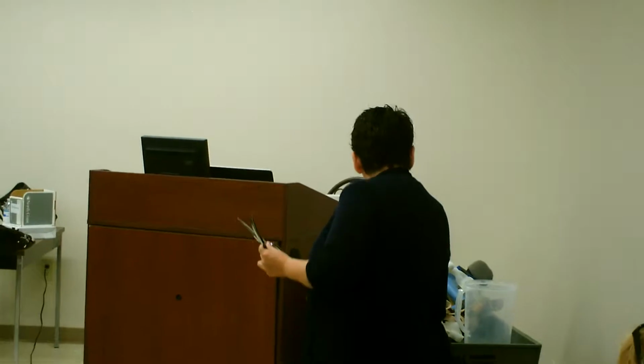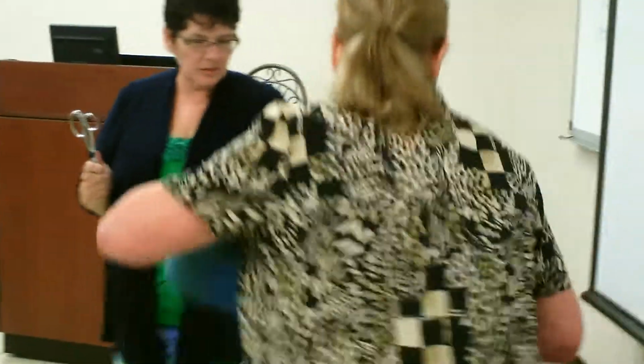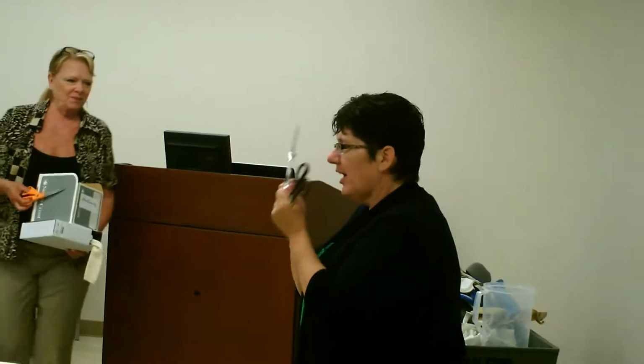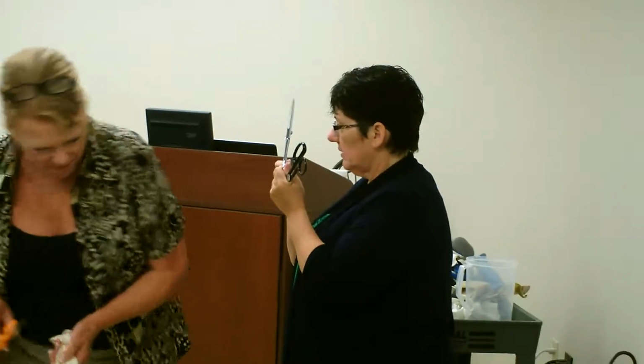Now, Miss Mary is going to yell at you if you use the wrong scissors. Okay? Now, I think we didn't bring our third pair of scissors. You have it? Okay. So we have 3 kinds of scissors. This is the splinting scissors. Do not cut anything else but splinting material with this. Do not cut hard material because you break the scissors. These scissors cost $100 a piece. Okay? If you cut hard material, you're going to get little, I call them jaggedy jags. Little sharp edges, okay, when you cut. So you got to cut soft material.